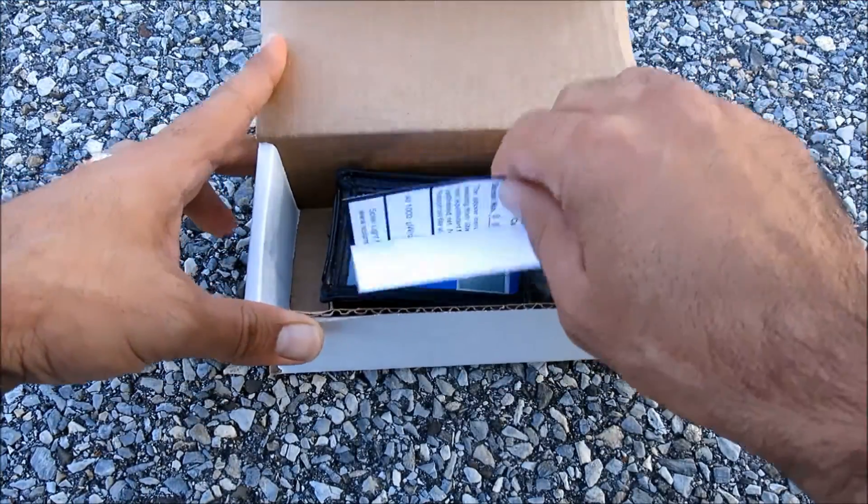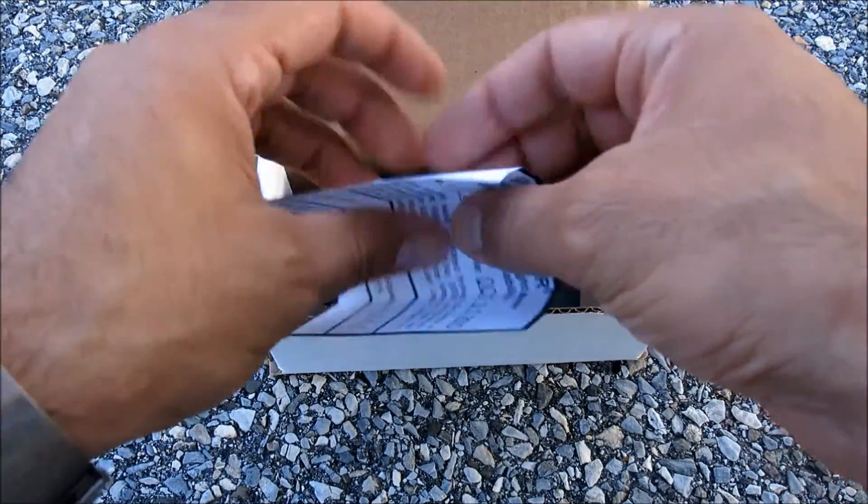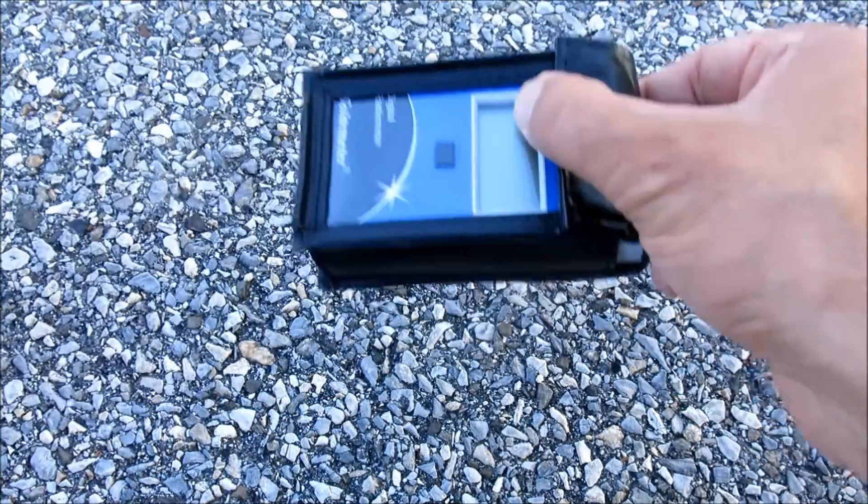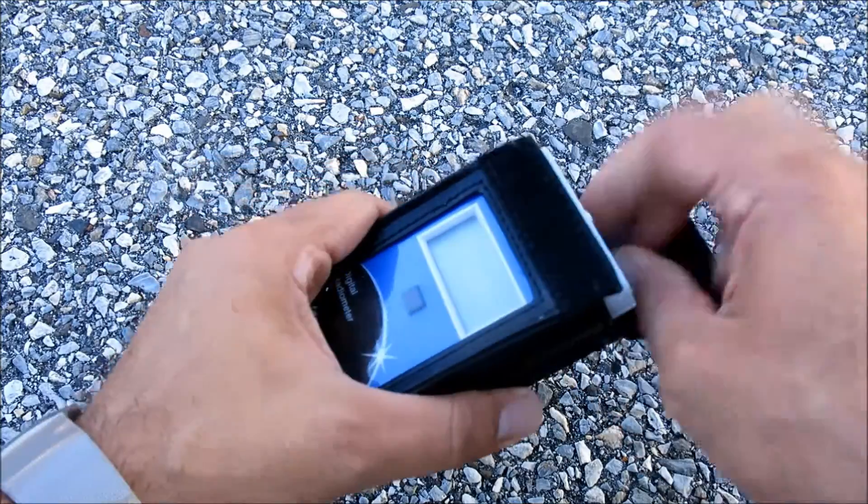Using the Solar Meter unit is easy. First, unpack it and store the calibration certificate for your records. Then remove it from its included carrying case.